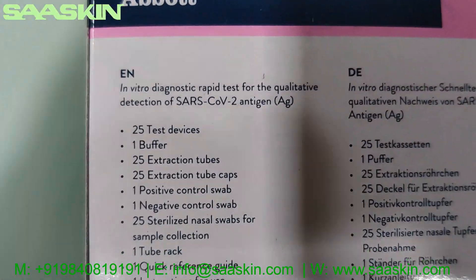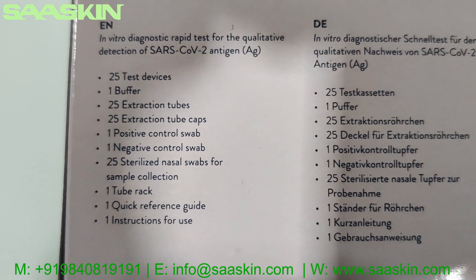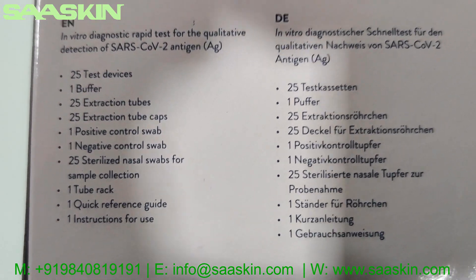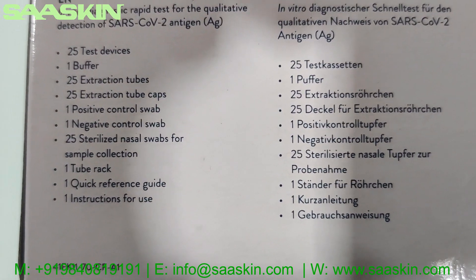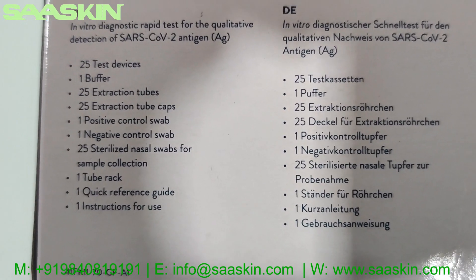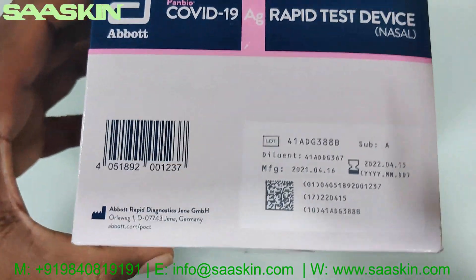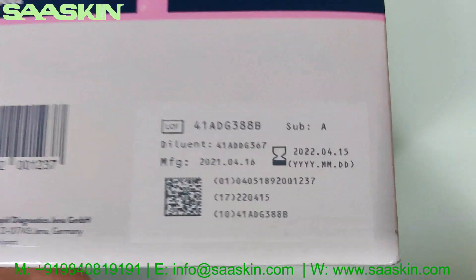The box contains 25 test devices, one buffer, 25 extraction tubes, 25 extraction tube caps, one positive control swab, one negative control swab, 25 sterilized nasal swabs, one tube rack, one quick reference guide, and one instruction for use.